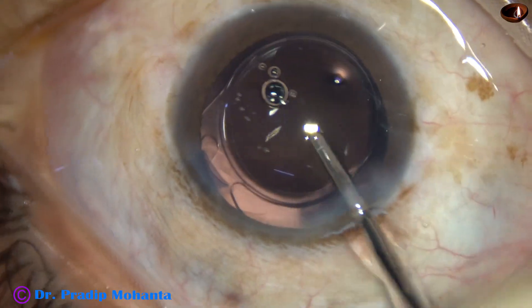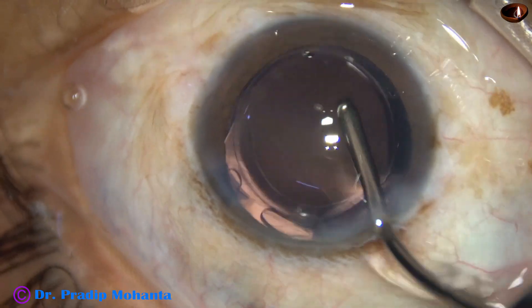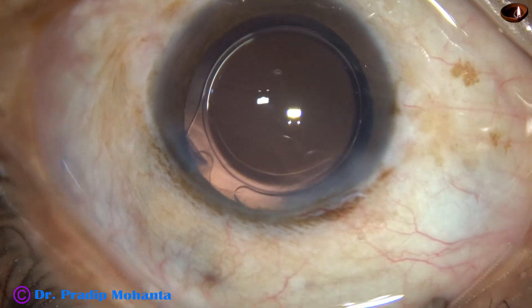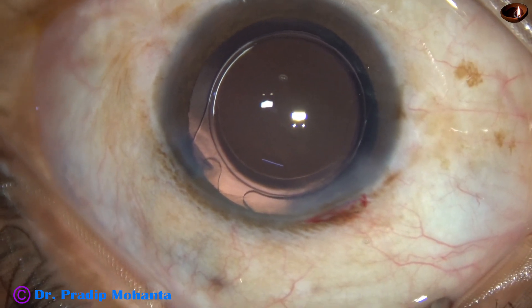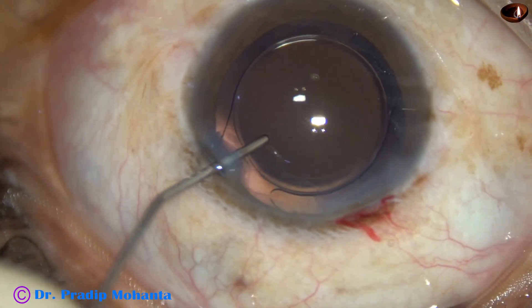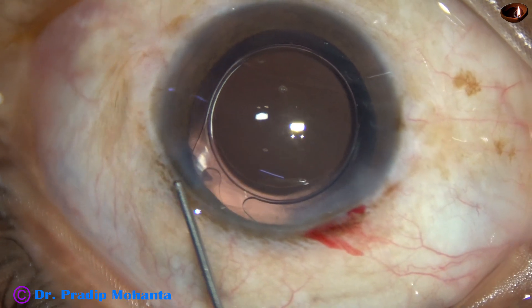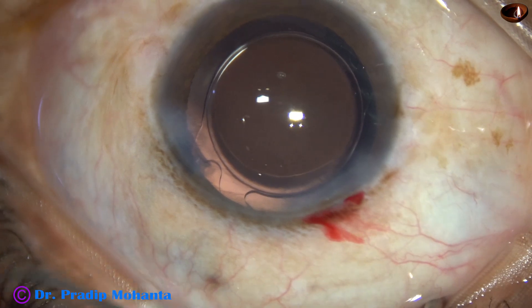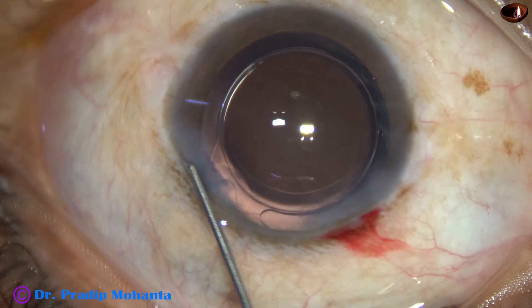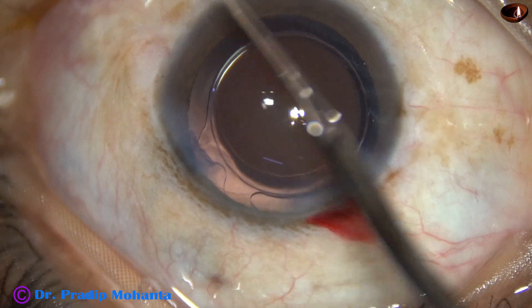And now, the irrigating probe is introduced through the main wound and the anterior chamber is nicely irrigated. Whatever visco was in the lumen of the cartridge comes out by this irrigation. And now, this is a bit of moxifloxacin. The side port has to be nicely closed — BSS is injected into the corneal stroma and the side port gets closed. In this case, we have only one side port.